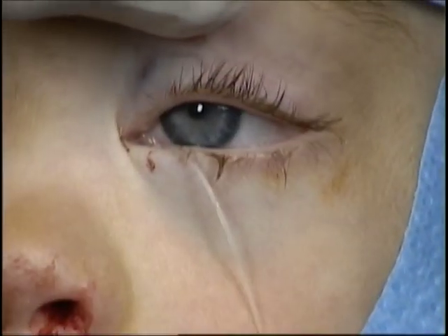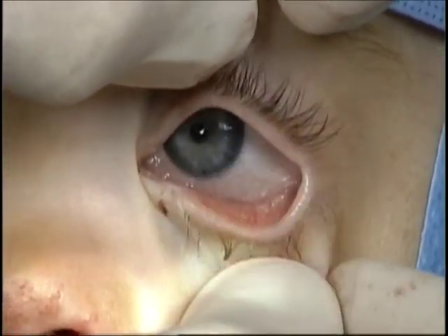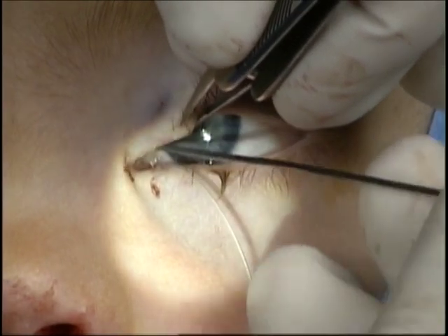The patient has had an attempt at placing the Crawford stent through the upper canaliculus. Unfortunately, a soft stop is encountered, as demonstrated with the Bowman probe.